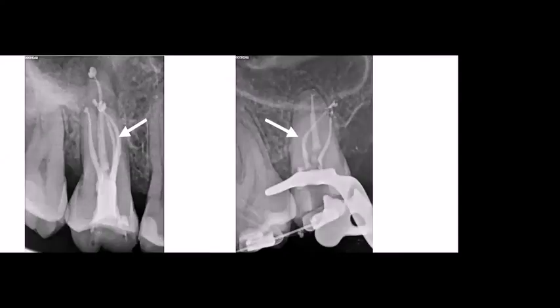This is the case after finishing the preparation and after filling the root canals. Another important thing that we have to keep in mind is not only the position of the curvature, but also whether the curvature is severe or not severe, and abrupt or not abrupt. If we have an abrupt curvature, so it changes the direction of the root canal quickly, the cyclic fatigue stress is higher than if we have a progressive curvature. If we compare two curvatures, the curvature on the left is progressive, and the curvature on the right is abrupt because it changed direction quickly.